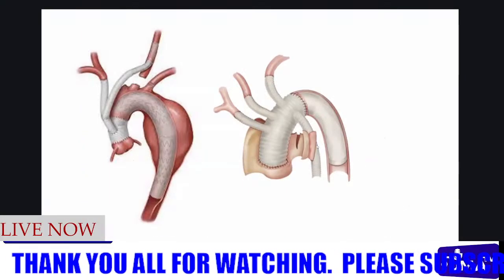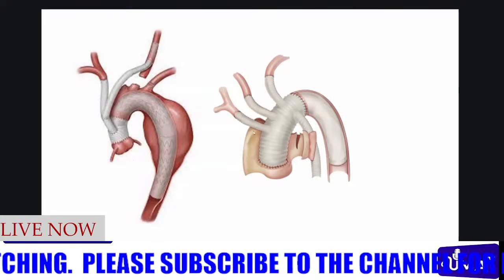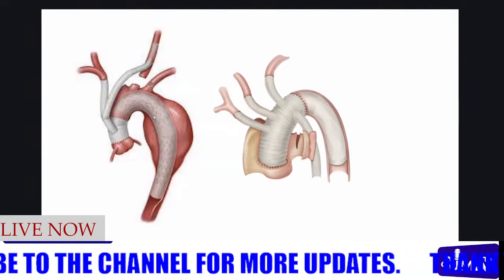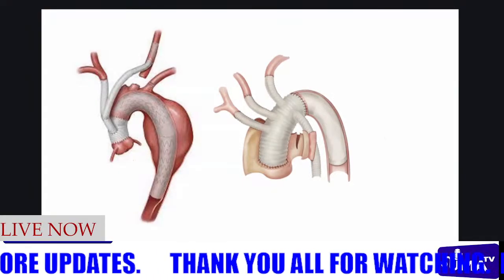So this is what we call an elephant trunk. By description, you know an elephant trunk? So this one replaces the root, the ascending, the arch, and then you drop a stent. That graft has a stent that is dropped into the descending aorta. In the case you have an inlet, the E2, E3.